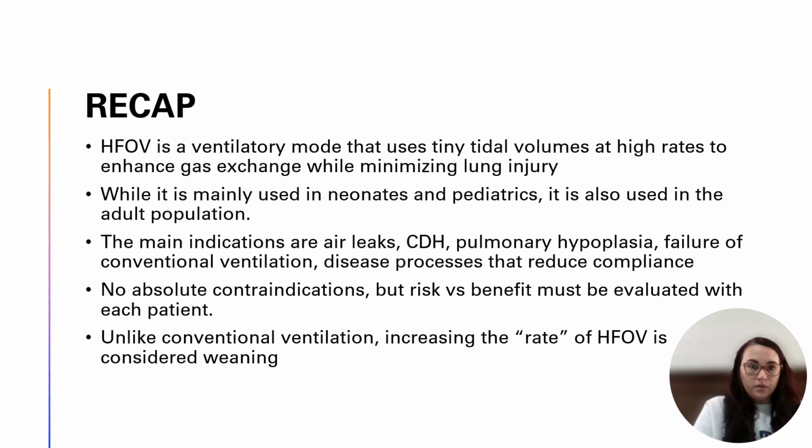Quick recap. So, HFOV is a ventilatory mode that uses teeny tiny tidal volumes at a really high rate to enhance gas exchange while minimizing lung injury. You're reducing that barotrauma, you're reducing that volutrauma, overall protecting the lungs. Generally used in neonates and pediatrics, but it can also be used in adults.